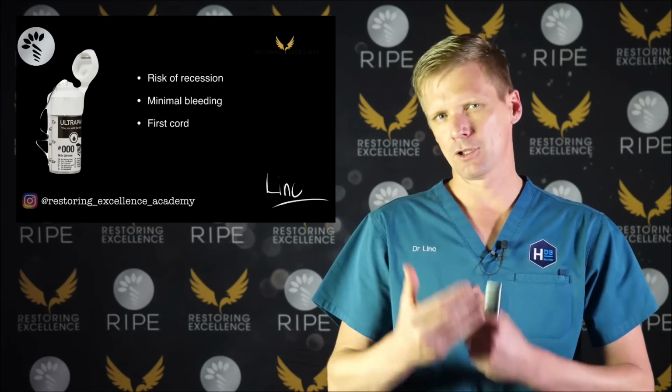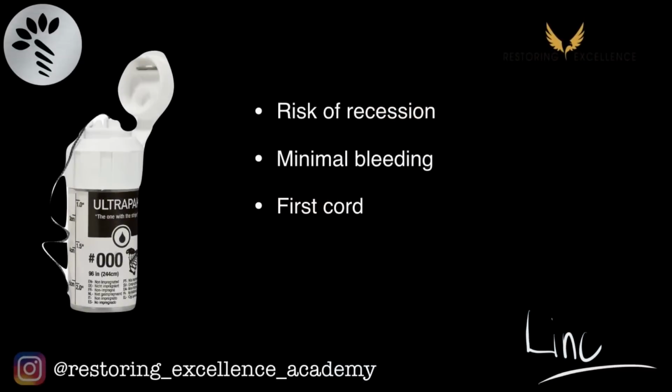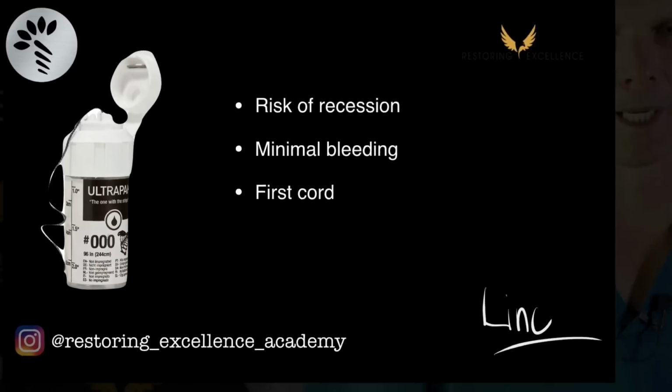I'm not really going to pack 2 really thick cords, because the first cord just sits at the base of the sulcus and it stops the sulcus immediately collapsing. But more importantly, when you pull a cord out, it's very common to get bleeding if you've had to pack it with any sort of force, unless you're one of those dentists whose patients come to the hygienist 5 times just before you do the crown prep. Most of us don't work in offices like that, so we have to control the bleeding. So the first cord stays in, and I'm going to use 000 for that.